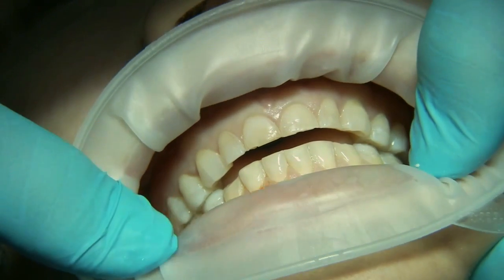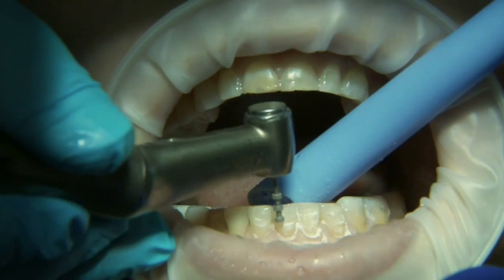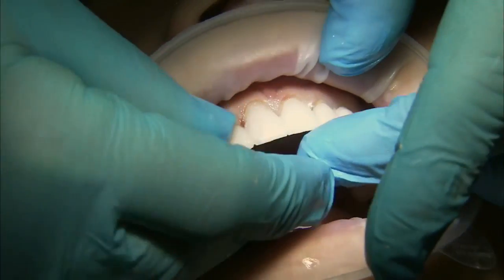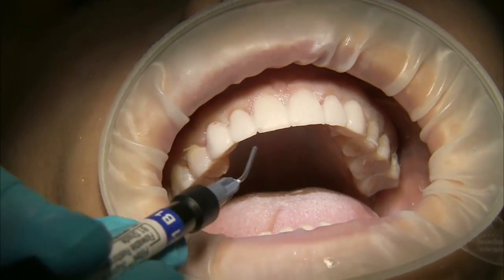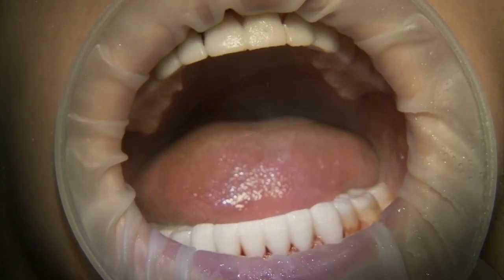And now we can do the front teeth. Prep the veneers on the bottom, prep the crowns up top. Temporaries are made. We'll make them removable or with crowns up top and then do a lock-on technique for the lower.